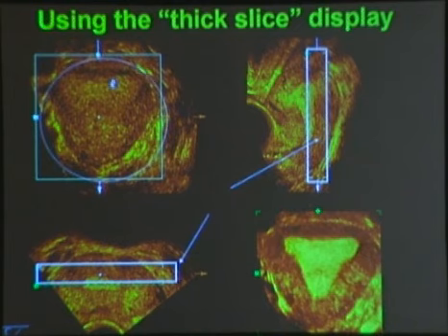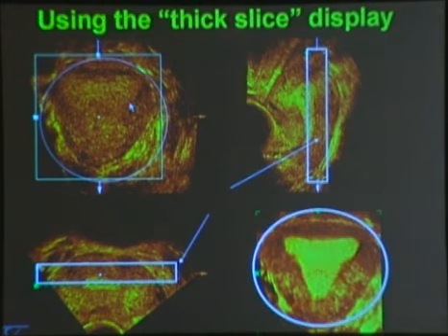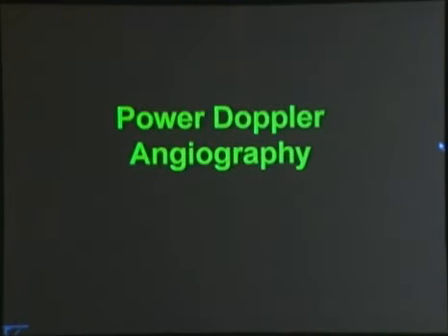And you can see the difference between box A and box C, where even in the not in the secretory phase, in the follicular phase, it is hard to see the boundaries of the endometrium. You can see them pretty beautifully in the render place if you collapse several successive planes into one, and that's the thick-slice display.